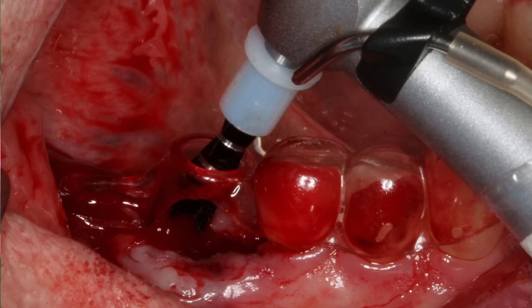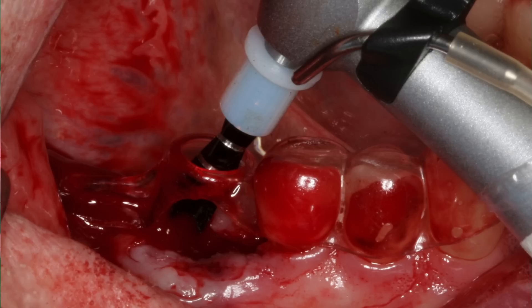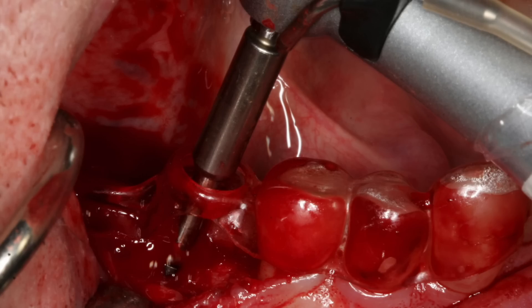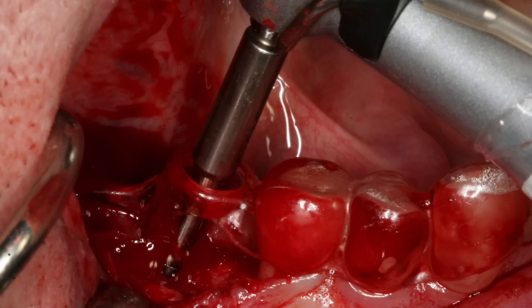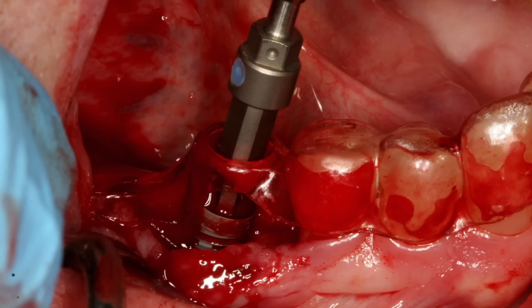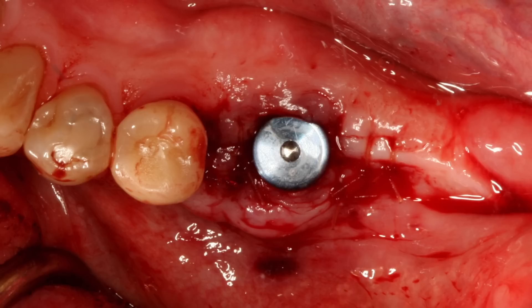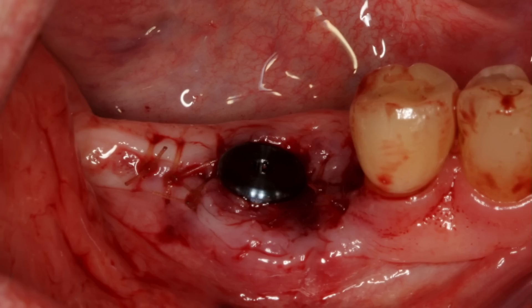The method is the same for each drill in the sequence. As shown for the final drill, the drill is inserted at an angle, rotated upright, and inserted to depth. The implant can be inserted through the guide, centering the implant driver in the guide hole. This can be quite helpful in type 3 or 4 bone when using self-tapping implants. The final images show the implant placed as planned in an ideal restorative position.